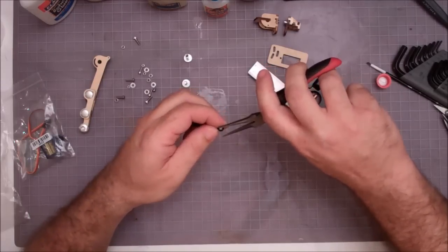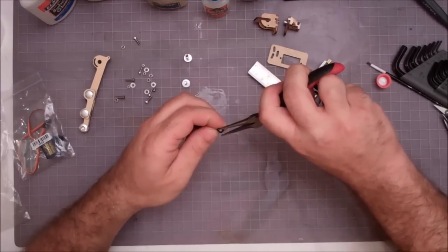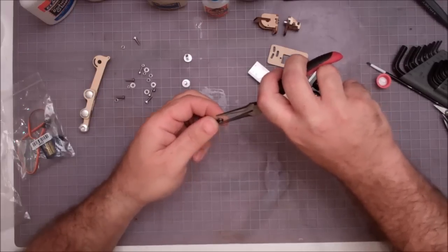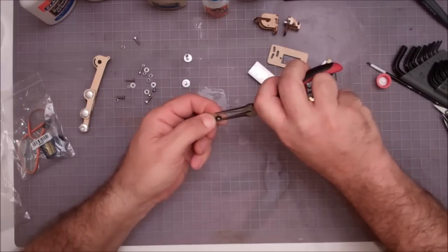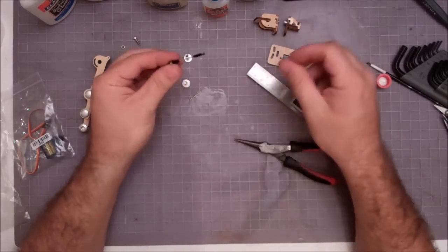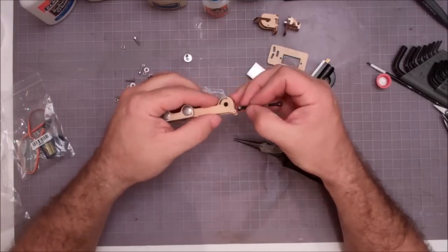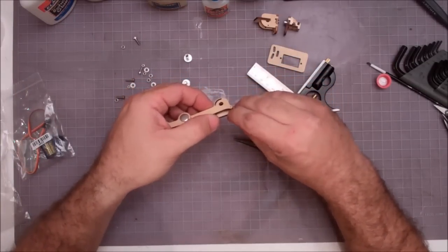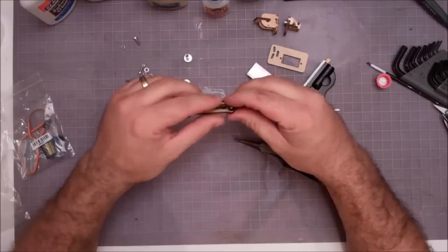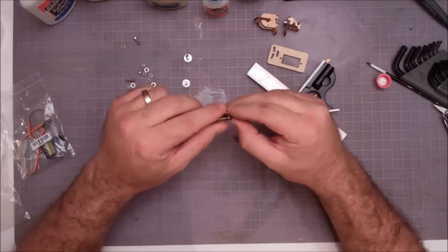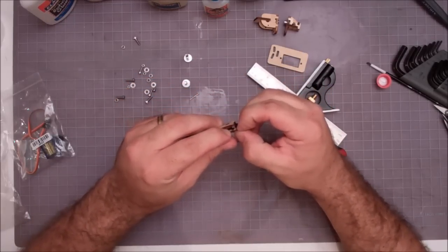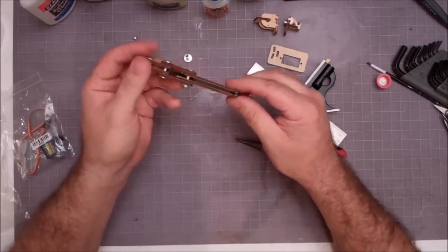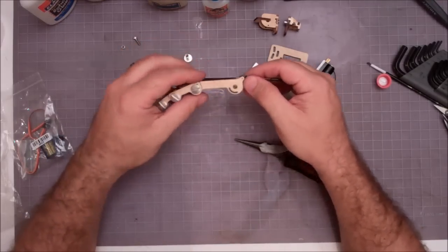Now this whole link piece can be inserted back into our finger. So we just kind of slide it in one side and then kind of pry the finger open a little bit and slide it in the other side. There you go, that's our driving link that runs the finger. Again, finger still moves nicely.